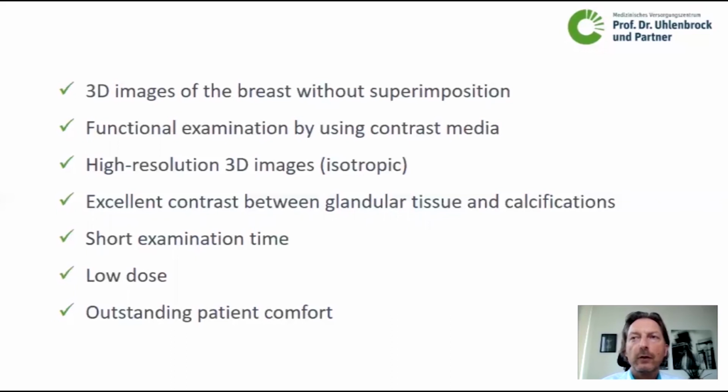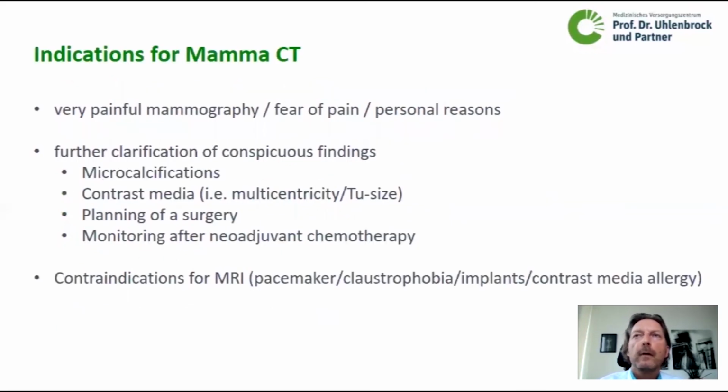We have a short examination time, about 12 seconds per breast, and 5 to 7 minutes for the whole examination. We have a very low dosage, and we have outstanding patient comfort because there's no compression or anything else which is bothering your patients. I see the indication for mammo-CT in case of very painful mammography and in fear of pain for the patient, or personal reasons or any other reason to reject doing a mammography.